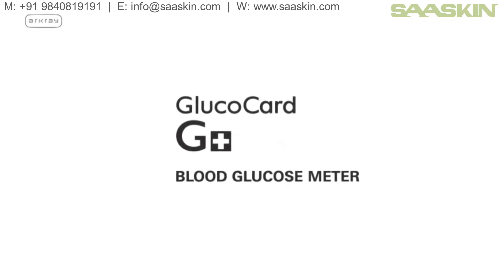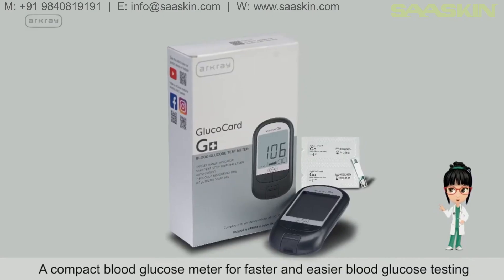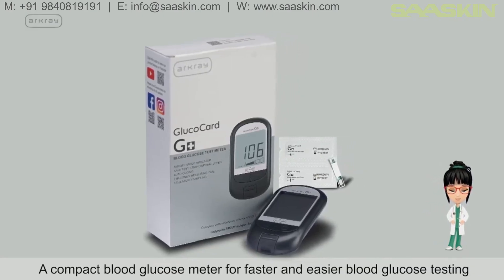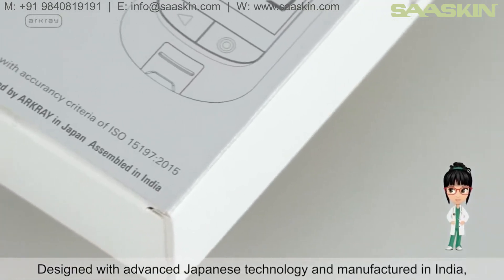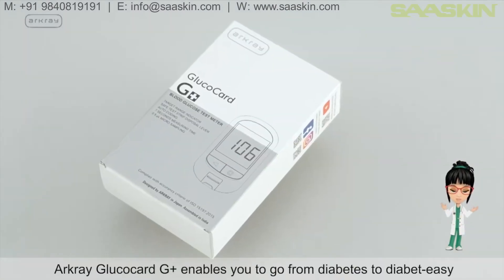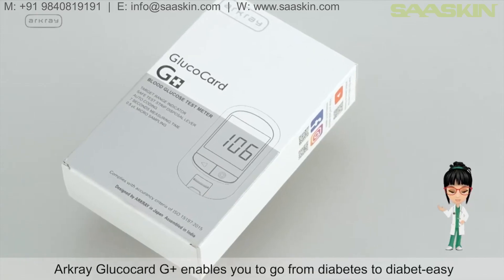R-Cray Glucocard G Plus Blood Glucose Meter — a compact blood glucose meter for faster and easier blood glucose testing. Designed with advanced Japanese technology and manufactured in India, R-Cray Glucocard G Plus enables you to manage diabetes more effectively.